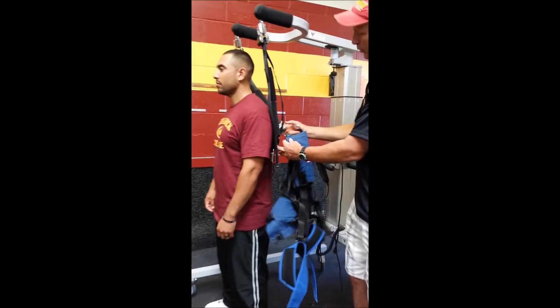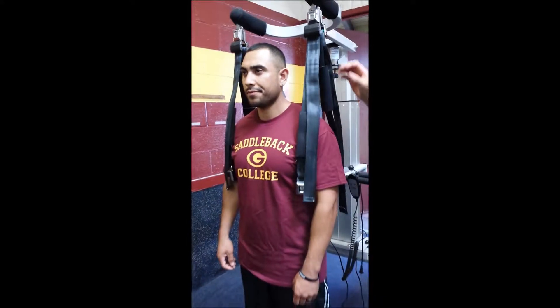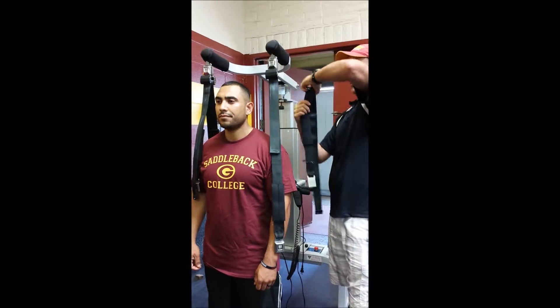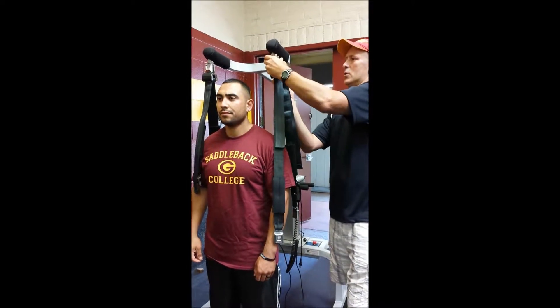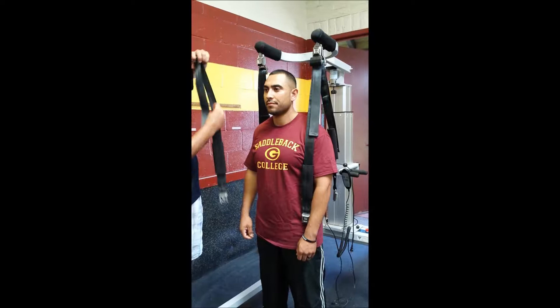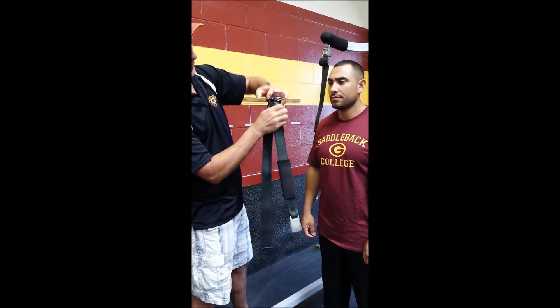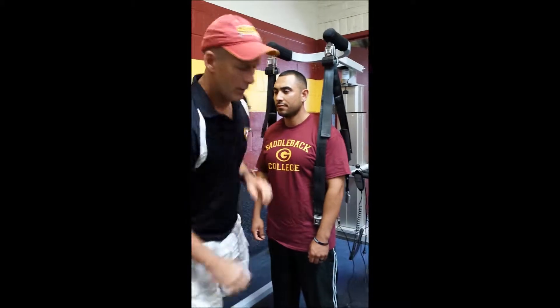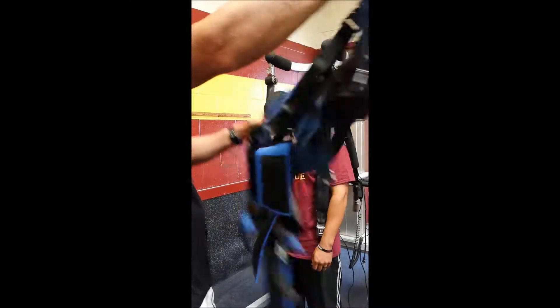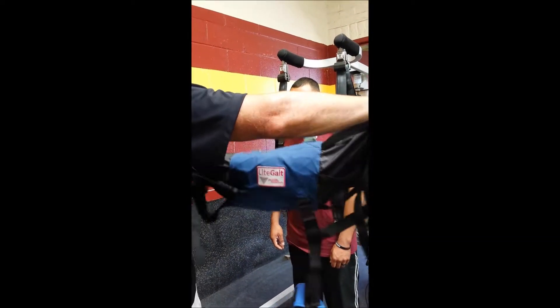I take this harness completely off — it has four belts, two around the front, two around the back. I want everything to be too long; it's always easier to go from too long and tighten it up than to have one too short with him already in it. So I'm going to make everything a little bit too long for Tim. It's like the flight attendant telling you to loosen your seatbelts. This is one of a few different harnesses. I know that right now this is the back side, and Tim's a pretty fit, thin guy so I think it's going to be too wide as it goes around him.